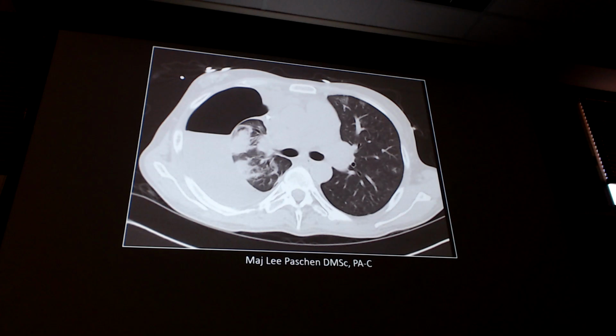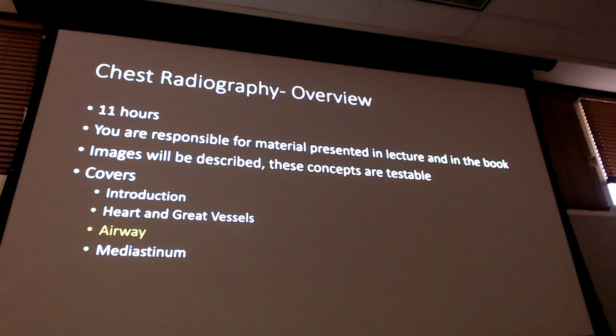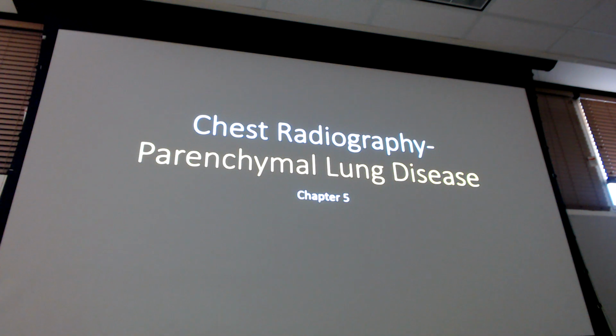Pneumothorax. And we'll look at some of these things and what they look like on x-ray, but then all good. Airway stuff. Parenchymal lung disease. Oops, turn it off.